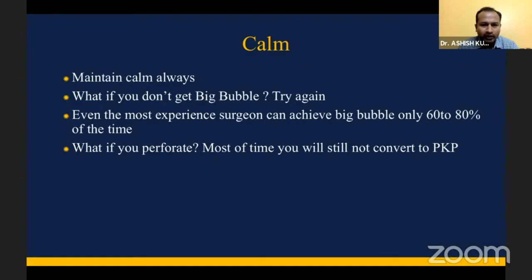What if you don't get a bubble? You can try again, give multiple attempts. And remember, even the most experienced surgeon can achieve Big Bubble only 60 to 80% of the time. So if you're not able to get it, it's not something you're missing a lot.